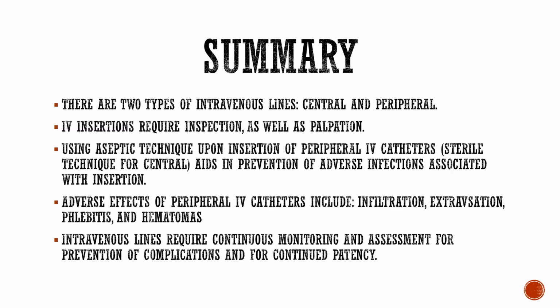For the summary of this presentation, we will review critical points for IV catheters. There are two types of intravenous lines, central and peripheral. IV insertions require inspection as well as palpation. Using aseptic technique upon insertion of peripheral IV catheters, sterile technique for central, aids in prevention of adverse infections associated with insertion.